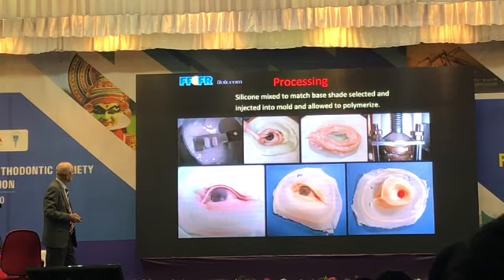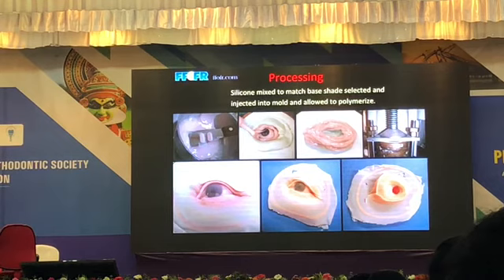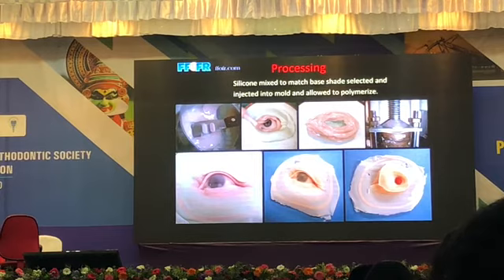And we mix, and it's a mixture by eyeball. We have the shade that we've selected, and we add pigment to the point where we create the same shade. So it is somewhat of an art. You know, this is where the technician has to have some experience doing this.